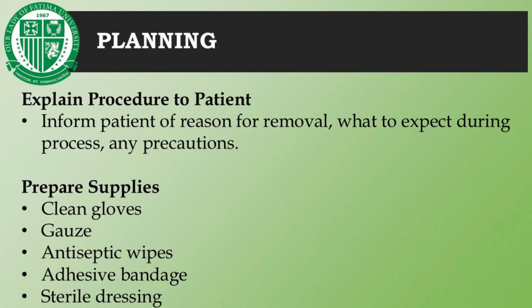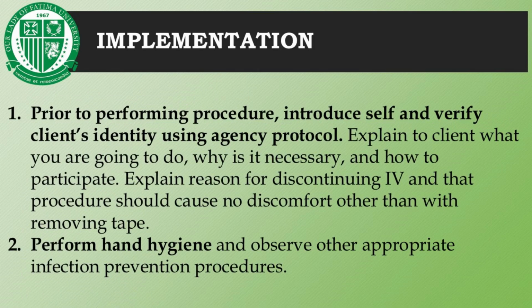Then, prepare the supplies needed, such as clean gloves, gauze, antiseptic wipes, adhesive bandage, and sterile dressing. In the implementation, prior to performing the procedure, introduce yourself and verify the client's identity using agency protocol. Explain to the client what you are going to do, why it is necessary, and how to participate. Explain the reason for discontinuing the IV and that the procedure should cause no discomfort other than removing the tape.